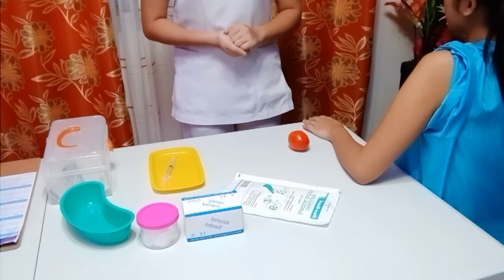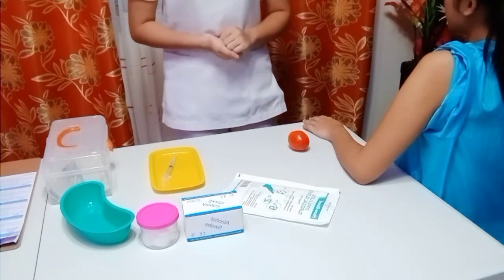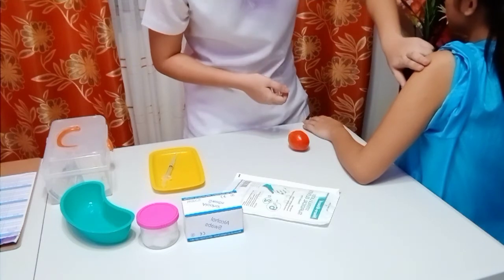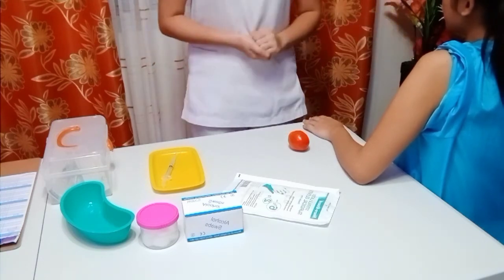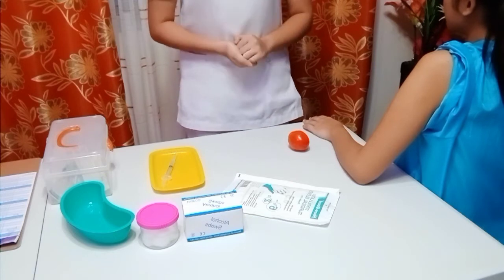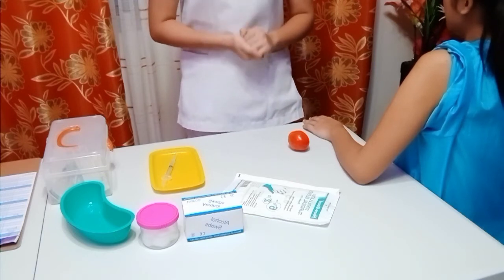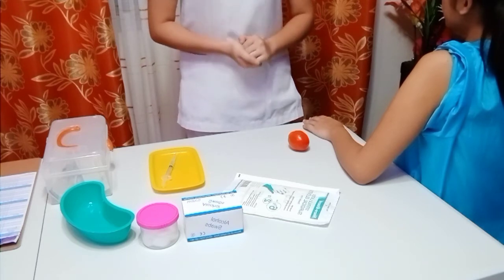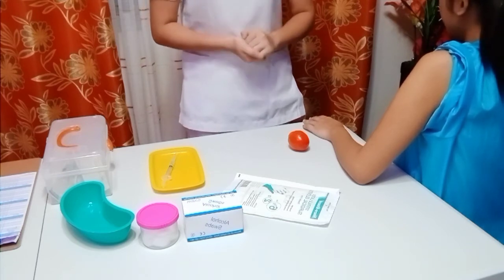Next is to locate the exact site for injection. Site identification decreases the risk of injury. Good visualization is necessary to establish the correct location of the site and to avoid damage to tissues.